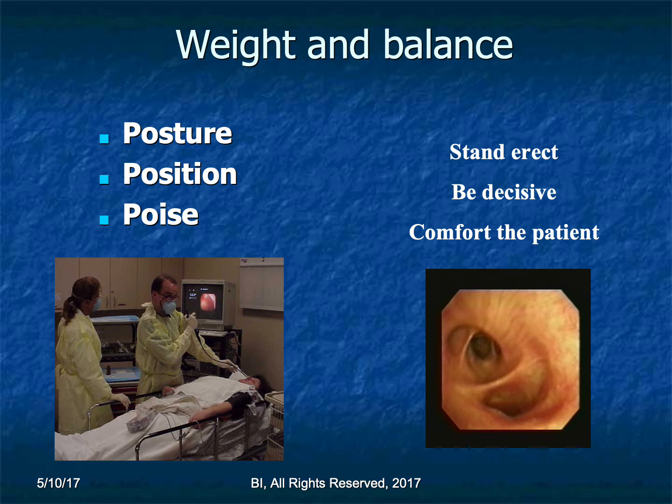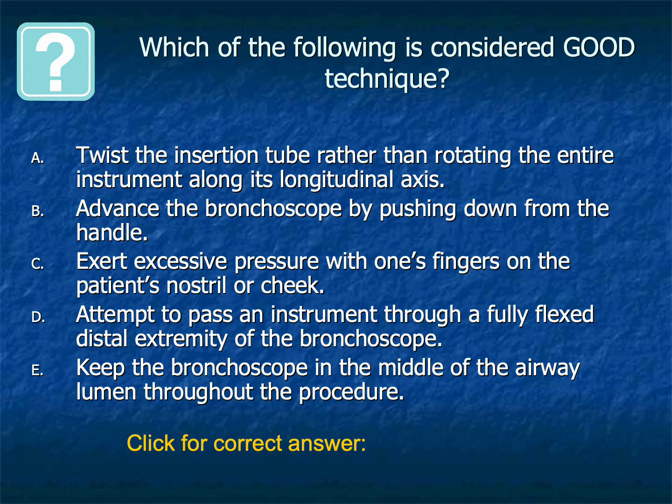Let's remember posture, position, poise. These words may sound unusually philosophical, yet they belong here, because bronchoscopy involves more than technical execution. The patient experiences the bronchoscopist's confidence, calmness, and decisiveness. Competence reassures. Confusion transmits itself. The recommendation to act decisively and to comfort the patient reflects procedural ethics as much as procedural technique.